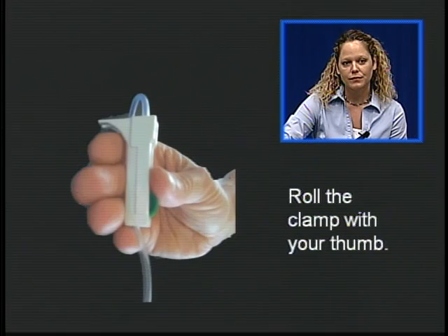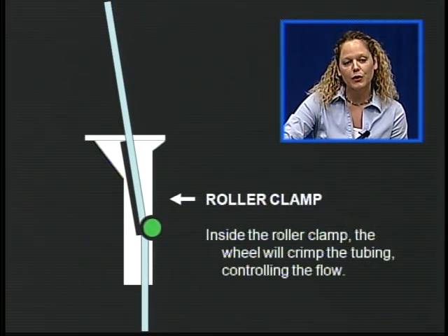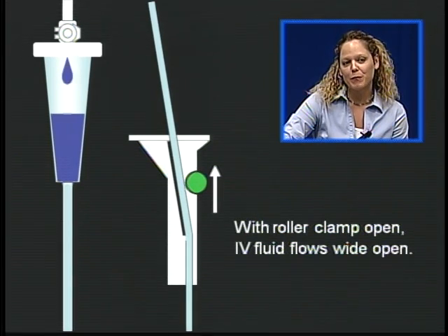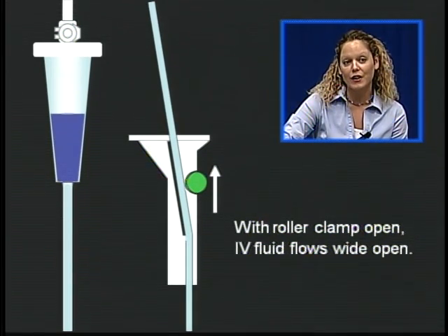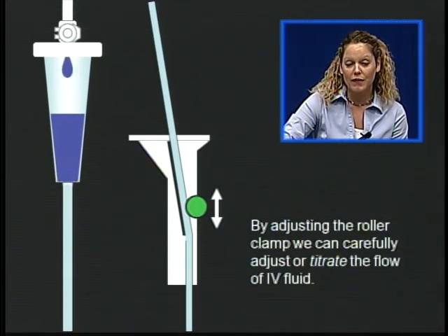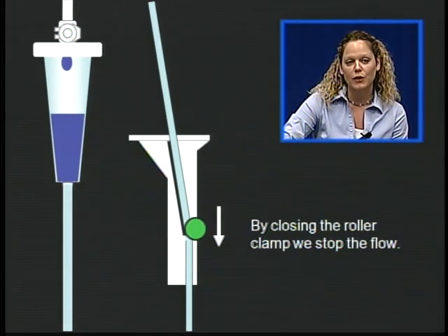Here's our roller clamp. We adjust the roller clamp using our thumb. Inside the roller clamp, we can see the wheel crimp the tubing, controlling the flow. With the roller clamp open, the IV fluid flows wide open. By adjusting the roller clamp, we can carefully titrate the flow of IV fluid. By closing the roller clamp, we can stop the flow altogether.